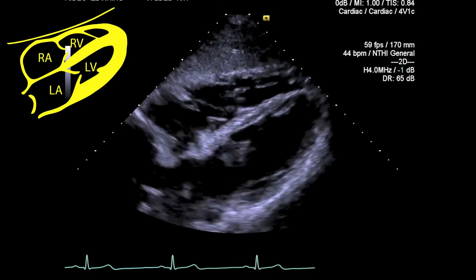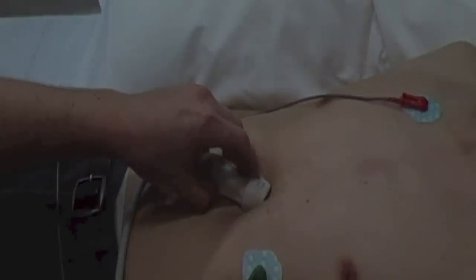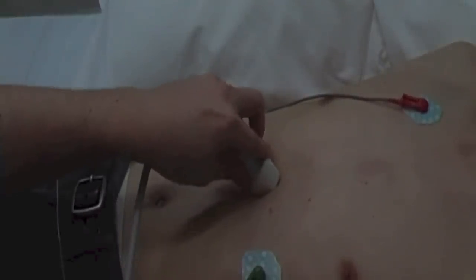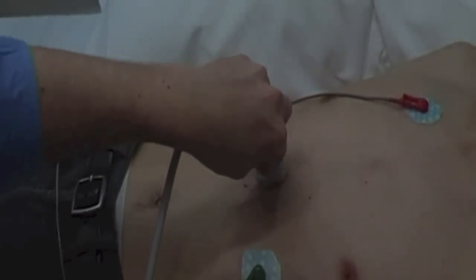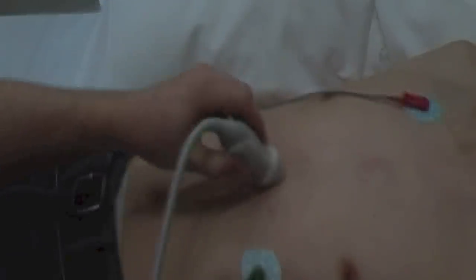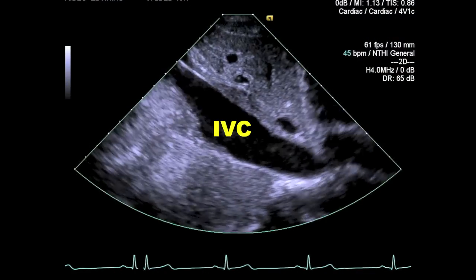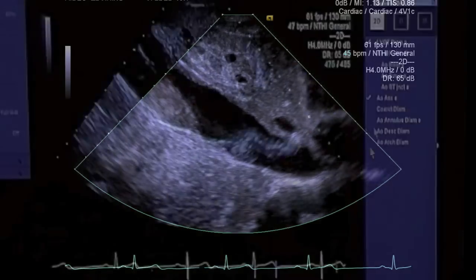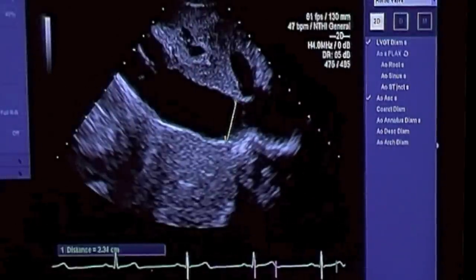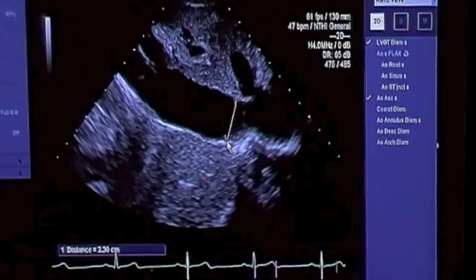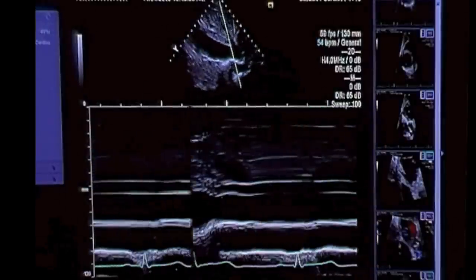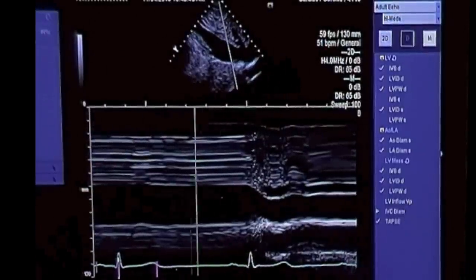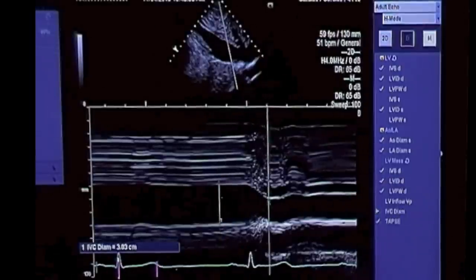From the subcostal four chamber view, rotate your probe anti-clockwise through 90 degrees with the probe marker now pointing to about 12 o'clock. By tilting the tail of the probe superiorly with the ultrasound beam directed through the abdomen to the IVC, you'll be able to visualise the IVC in long axis draining into the right atrium. You can measure the size of the IVC usually at about one centimetre proximal to the hepatic vein. In a non-ventilated patient, you can estimate the right atrial pressure by determining not only the size but the variation in size with respiration or a quick short sharp sniff.